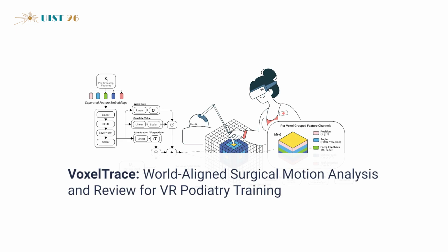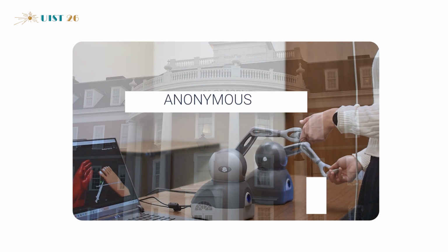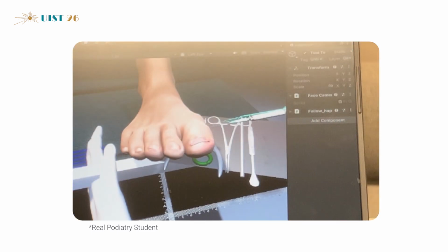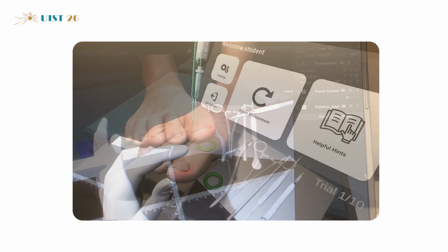VoxelTrace, World-Aligned Surgical Motion Analysis and Review for VR Podiatry Training. Medical institutions are increasingly turning toward surgical simulation to reduce material costs and enable repeatable practice. Prior work has explored VR surgical simulations and its effects on student training.